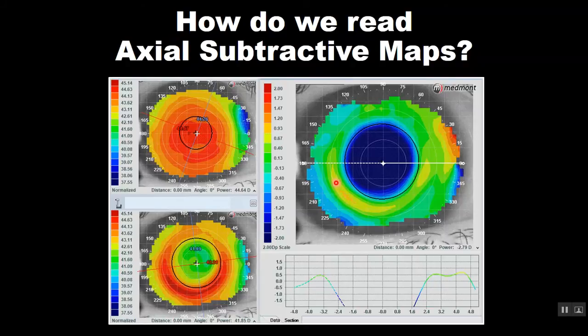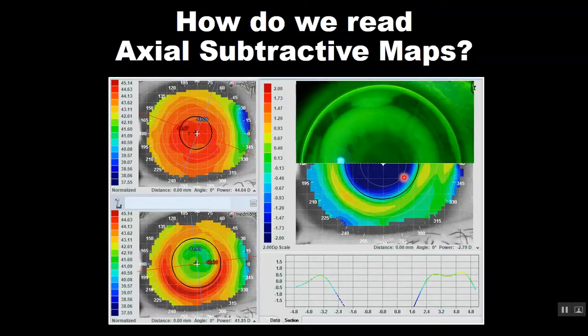So what creates this blue treatment area? Let's overlay a fluorescein pattern. And where the lens is close to the cornea, where the tear film is very thin, you create a compressive force pushing on the epithelium. Where you see this reservoir here, where you have a thick layer of fluid, you create a suction force. And that's what creates this yellow, orange, or hotter contour here.